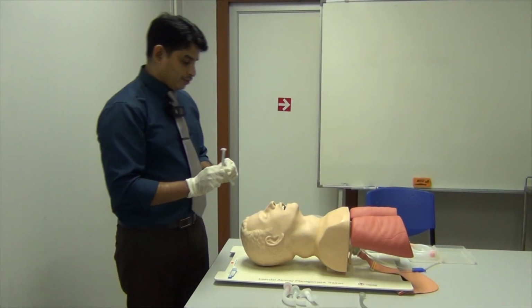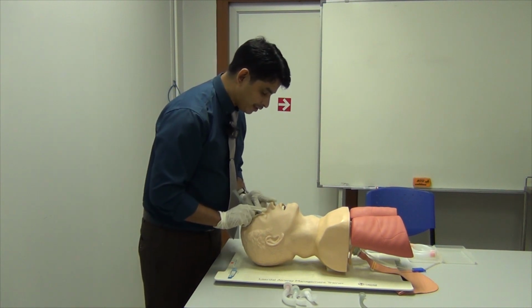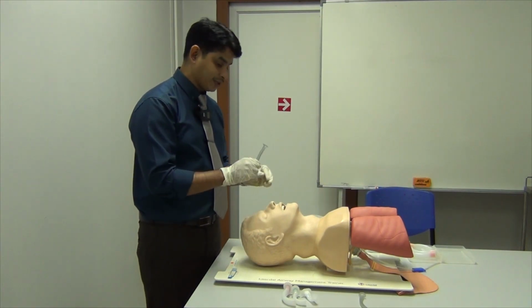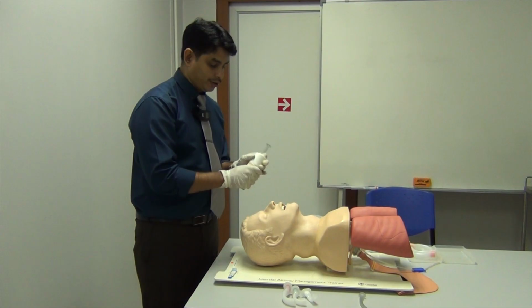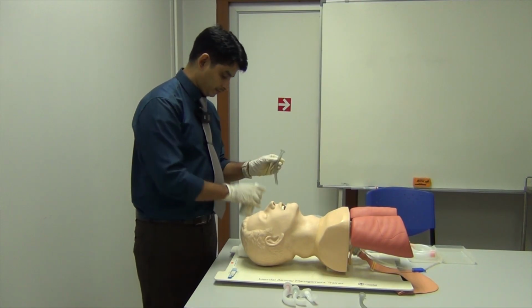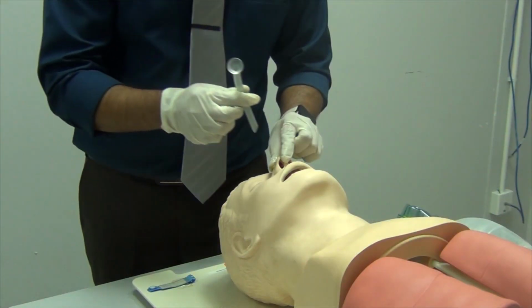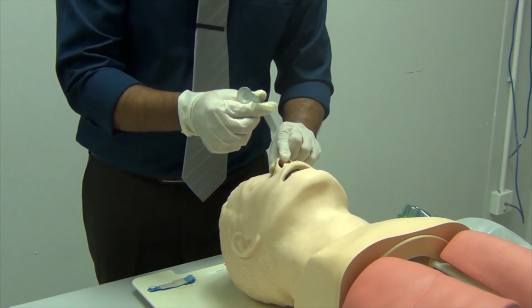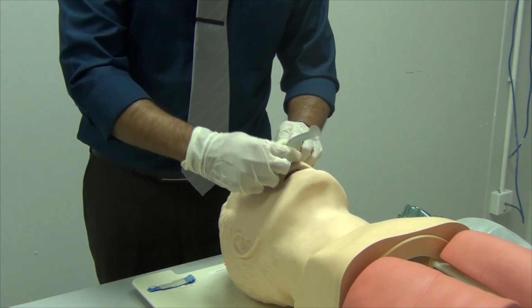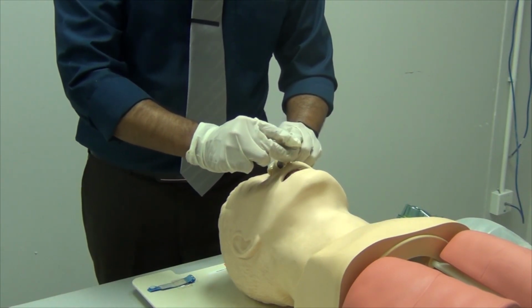So how do you introduce it? Always inspect the nasal cavity, look for any septal deviation or any turbinate hypertrophy and choose accordingly. Before you introduce it, you have to lubricate it. Lubricate well. Once you have done the lubrication, raise the nostrils. The right side is usually preferred. Introduce in a gentle fashion, minimizing the injury to the tissues.